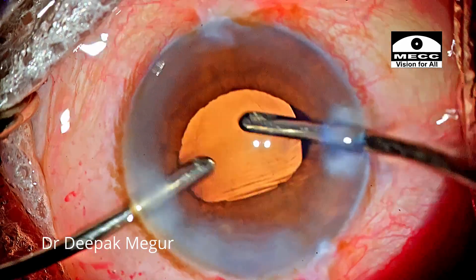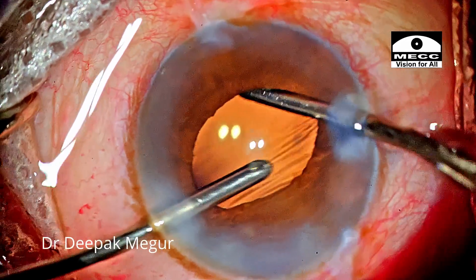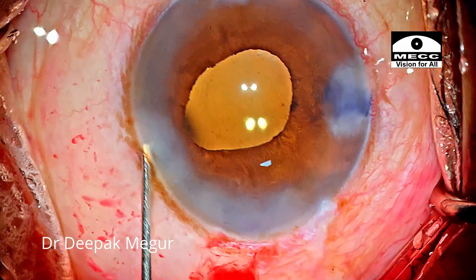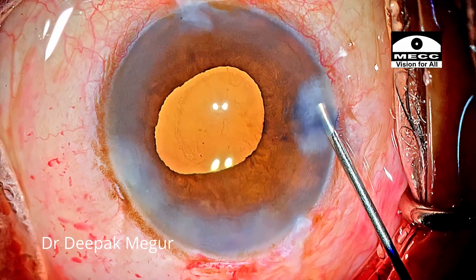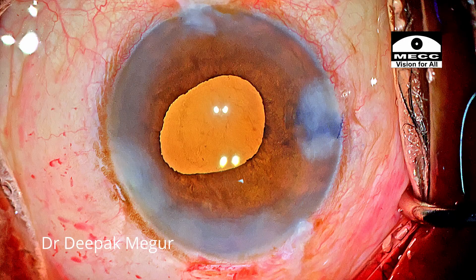To begin with I was skeptical how the case would go because of the immediate iris prolapse after OVD injection. Thankfully everything went well and the patient continues to do well.